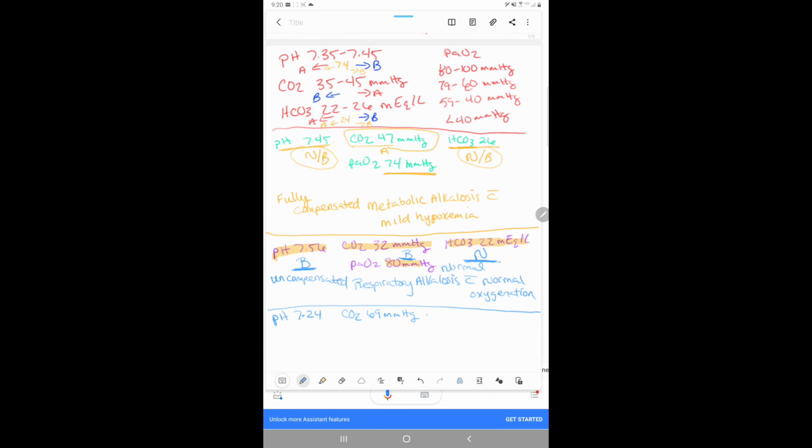And then their bicarb is at a 27. And then their PaO2 is 43. You see that 43 and think, oh, wow, that's pretty low.